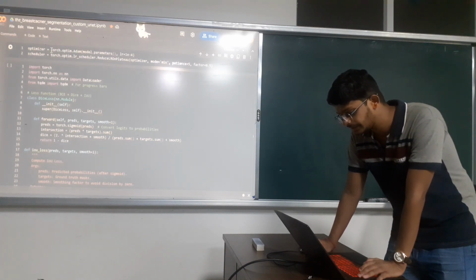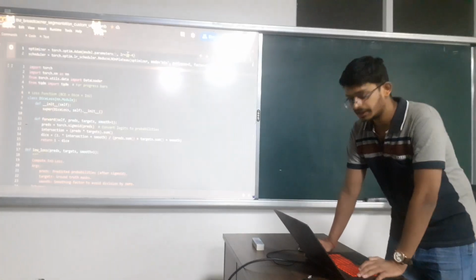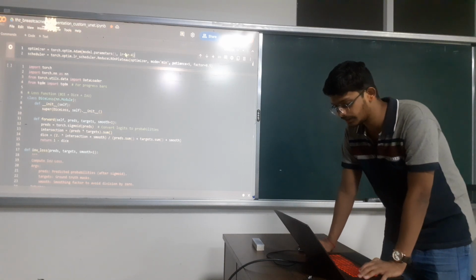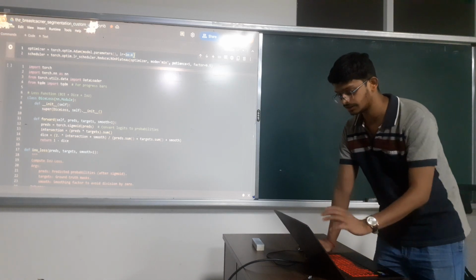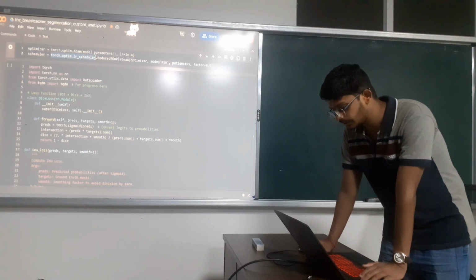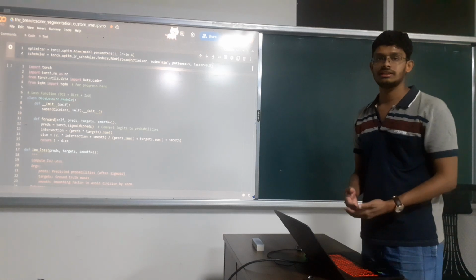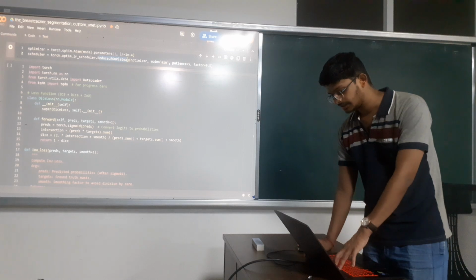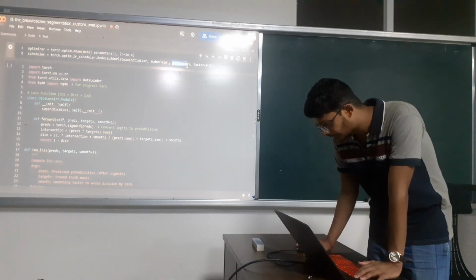The optimizer that I used here is torch.optim Adam optimizer with a learning rate of 10 to the power minus 4. I have tested many learning rates ranging from 0.1 to 10 to the power minus 4, but the best result with the hyperparameter tuning is with 1e-4. And the scheduler that I have used is torch.optim LR scheduler. What this does is the learning rate is adjusted with plateau detection from this ReduceLROnPlateau function. This is done with each epoch, with a patience level of 5 and factor equals to 0.5.